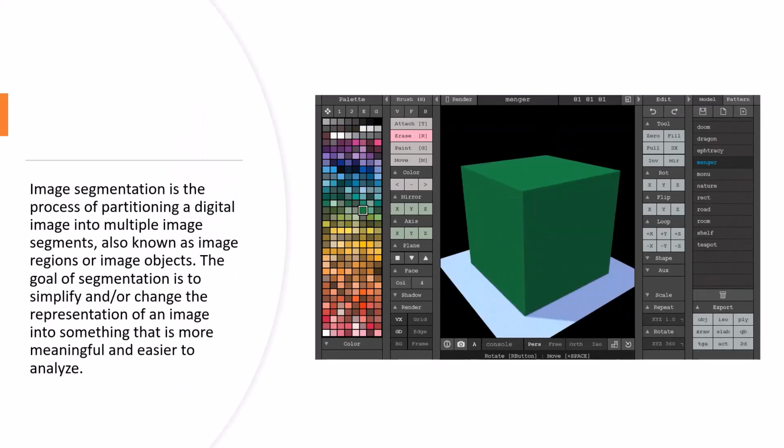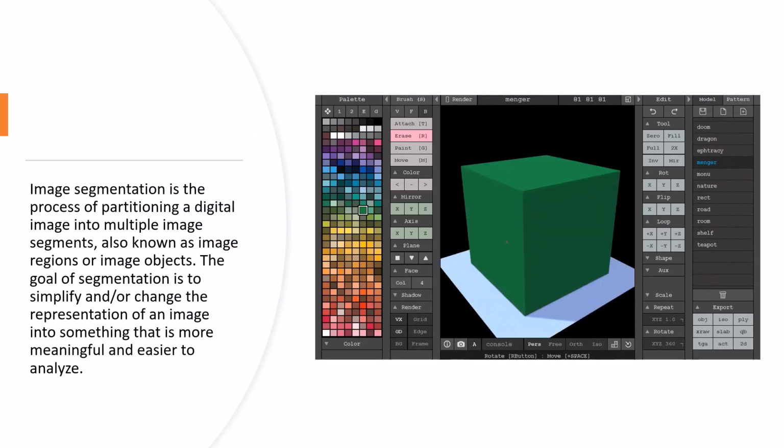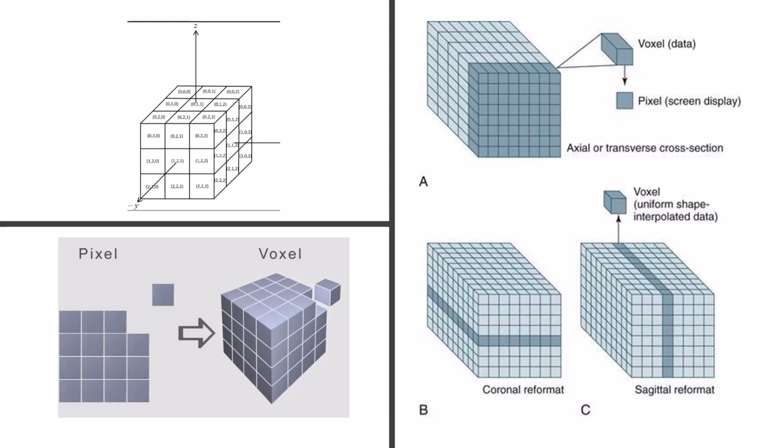The goal of segmentation is to simplify and/or change the representation of an image into something that is more meaningful and easier to analyze.